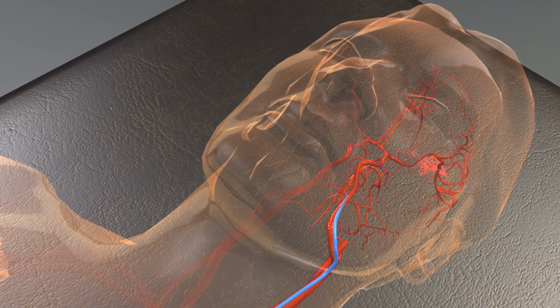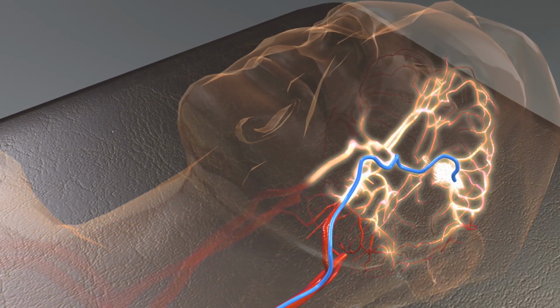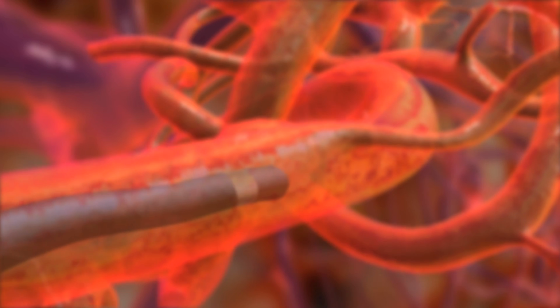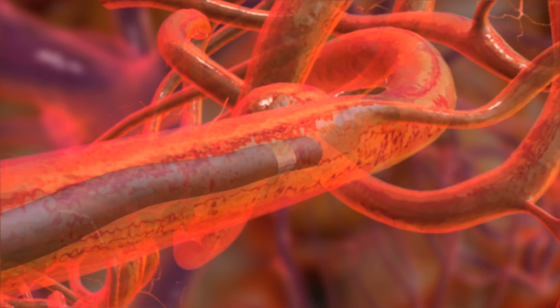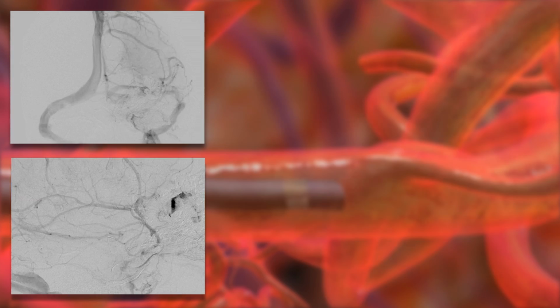Ensure optimal microcatheter placement with the injection of contrast agent per institutional procedure. Based on clinical practice, it is helpful to establish a working projection that visualizes the distal few centimeters of the microcatheter. Because ONYX will reflux during the procedure, it is important to have clear visualization of the catheter tip and any vasculature that must not be occluded by ONYX. Establish a reference image revealing the distal catheter shaft, nidal angioarchitecture, and venous outflow.